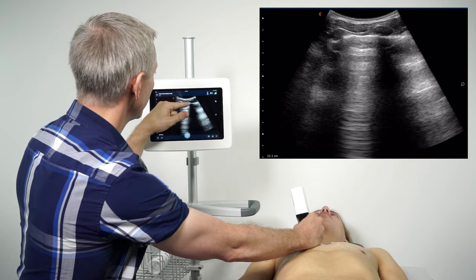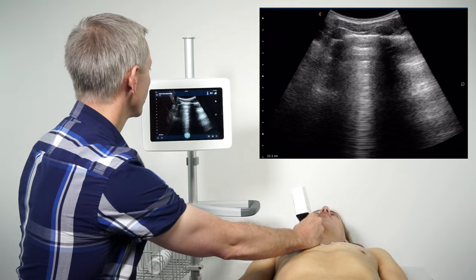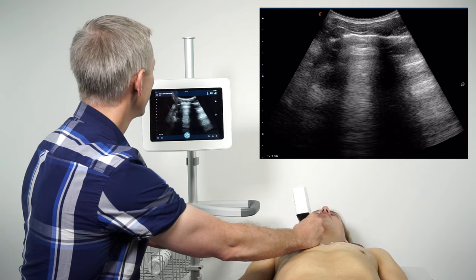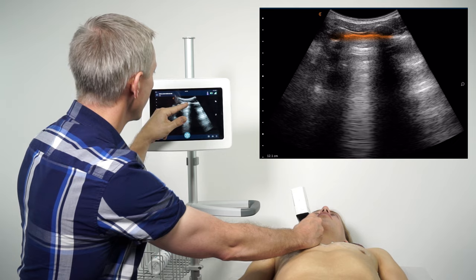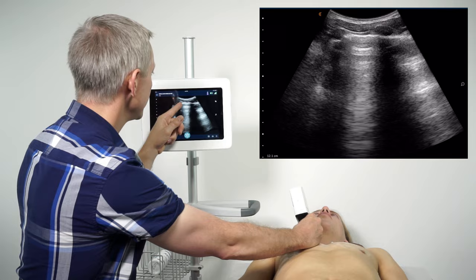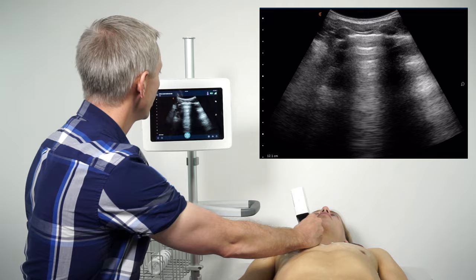Once I've identified the pleural line, I want to describe a couple of artifacts seen in a normal lung scan. Focusing on the pleural line itself, we can see some motion artifact across that horizontal line. This can be seen as either sparkling or scintillation — some people describe it as ants marching across the pleural line — which indicates that the two pleura, the visceral and parietal, are opposed to each other.